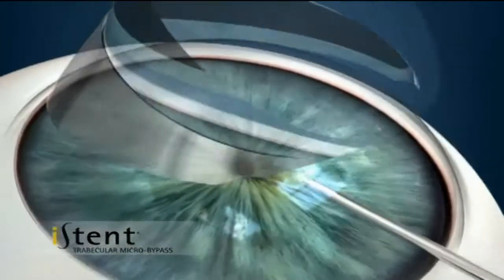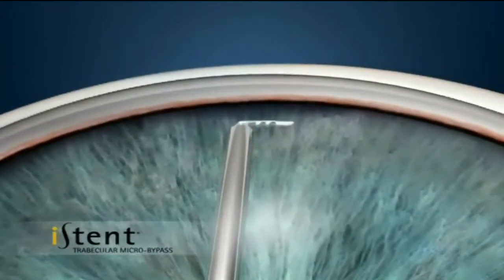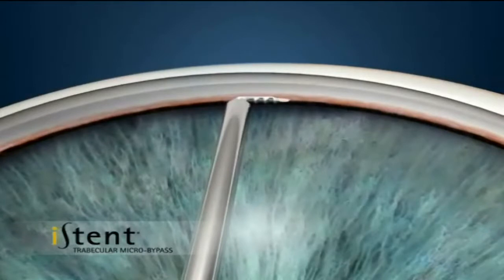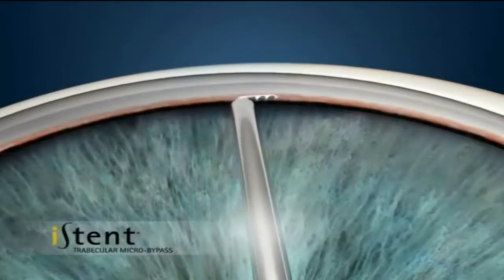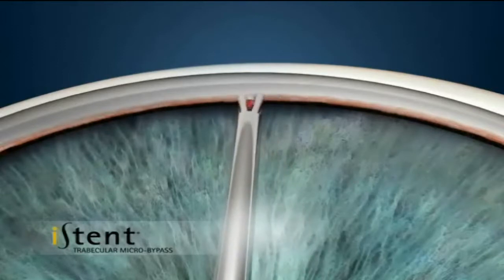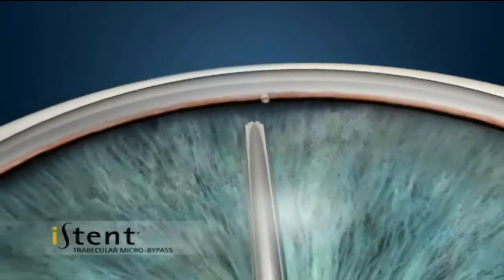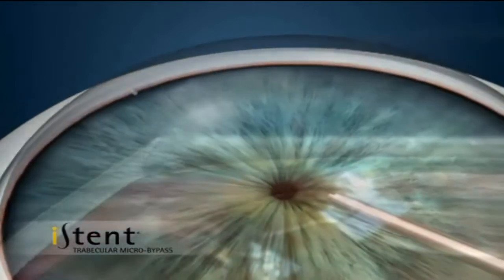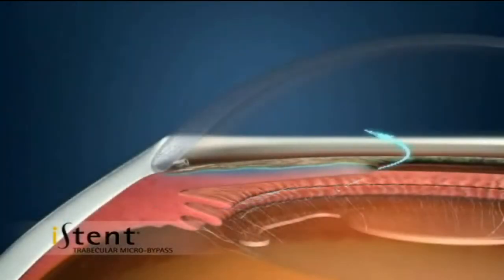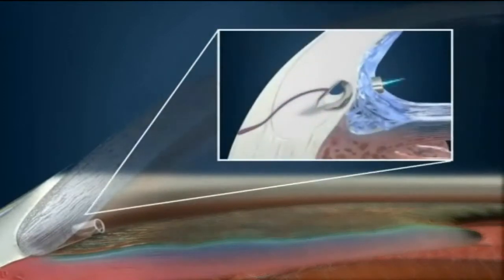This little titanium device is implanted into the meshwork, which is basically the internal drain of the eye, just at the periphery of the iris here. We put this device in the meshwork, and it is designed to go in and stay there. We just make sure it's secure. Once that device is in place, it's perfectly safe and it increases the fluid outflow of the eye to lower eye pressure.